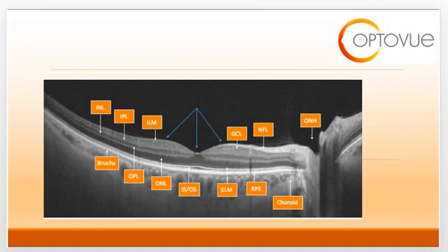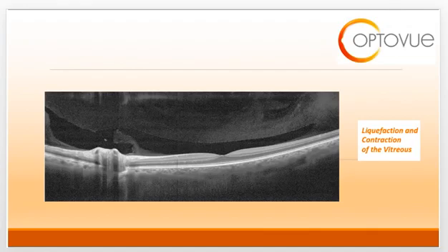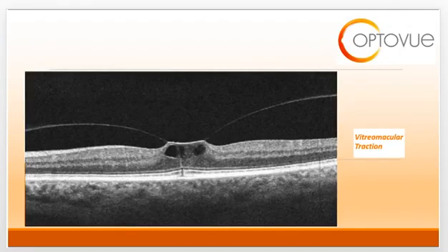In the previous webinar I introduced the topic of vitreo-macular interface disorders. On this OCT scan you can see the blue arrows pointing to the area that would be affected. We spent quite a lot of time talking about the normal aging of the vitreous body, including liquefaction and contraction, which lead to posterior vitreous detachment and separation of the posterior hyaloid from the macula. We also talked about situations where the posterior hyaloid does not separate normally, resulting in vitreo-macular traction formation.